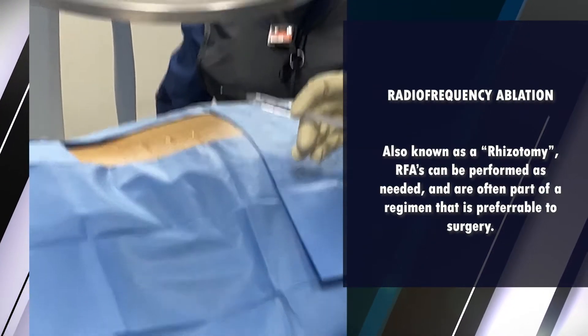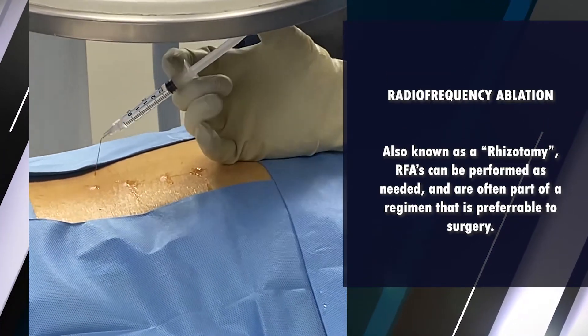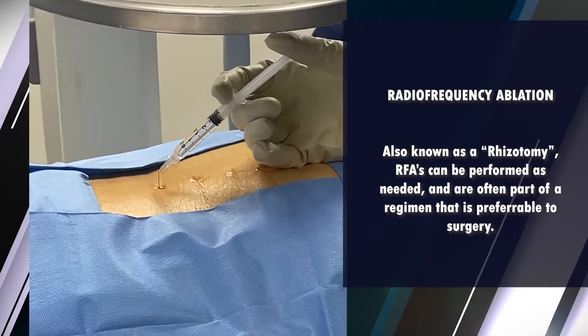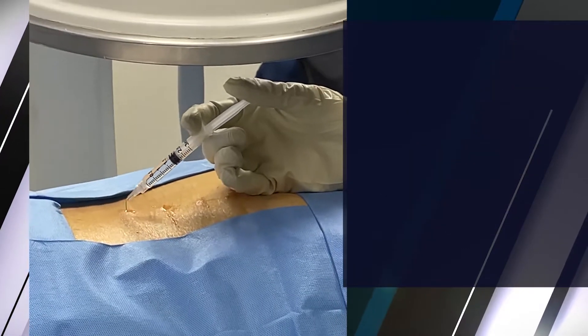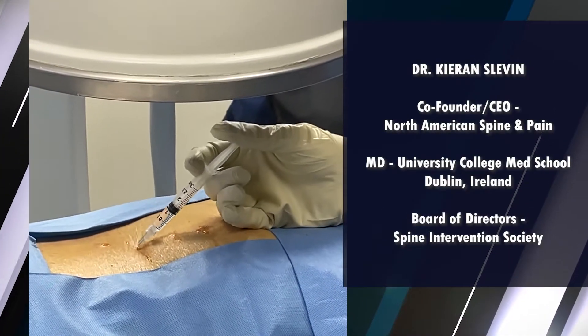I'm just going to re-follow my initial tracks and the angle that the needle is going to take, from the top down here. Careful attention not to numb or anesthetize too deep is important.